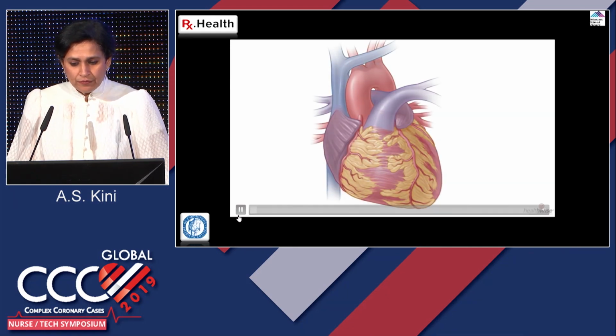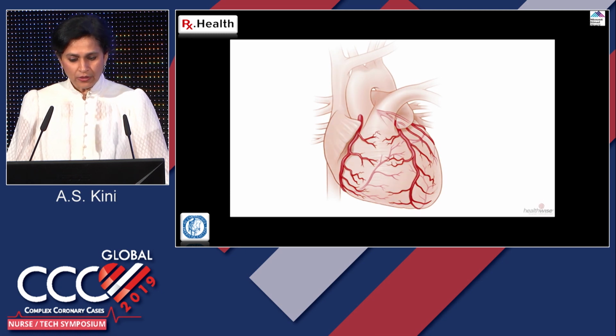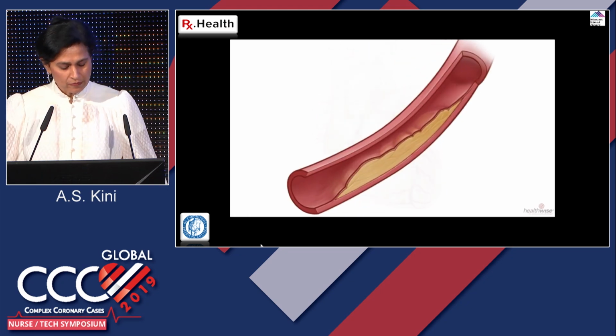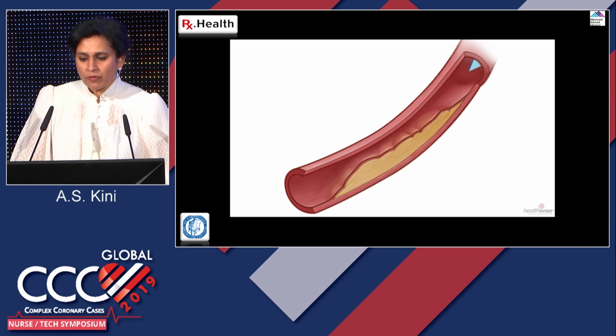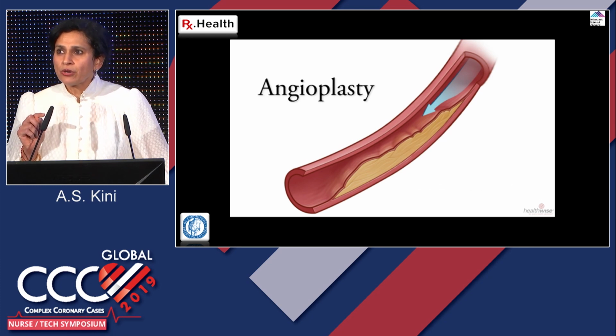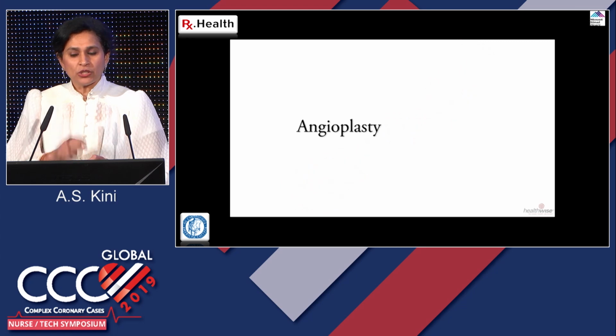Coronary arteries have a really important job. They carry blood... why can't we hear the sound? ...to the heart. But if you have heart disease and one of those arteries gets narrowed or blocked by plaque, that flow of blood slows or even stops, and that can cause a heart attack. This particular video about the procedure will be sent to the patient so that they don't think some hammer and chisel is going into their artery.